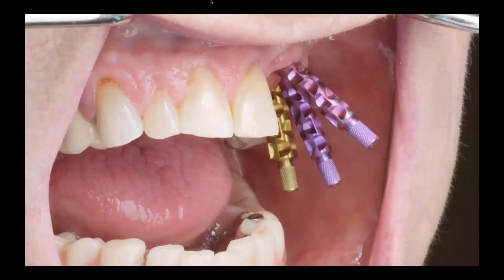I like starting my implant talks with a couple of pictures. Some of you who I've lectured with before or done courses with, I think, enjoy some of these photos, but let's think about the question of why we're here in the first place. This is a good example.